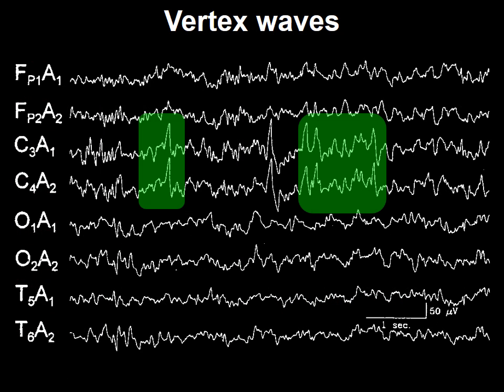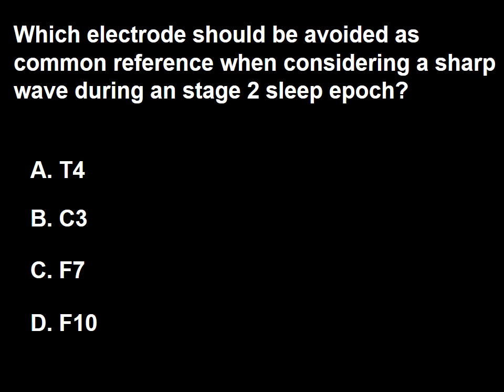This activity will contaminate a central common reference electrode and make analysis of the waveform difficult. So the answer to this question is B.